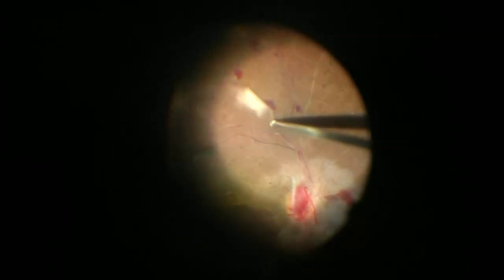As you begin to dissect these membranes, you will have the opportunity to start detaching the posterior hyaloid. Here, don't rush and proceed calmly. Always visualize the tip of the vitrector to ensure you don't grasp a piece of retina hidden beneath those membranes. Patience is the key.